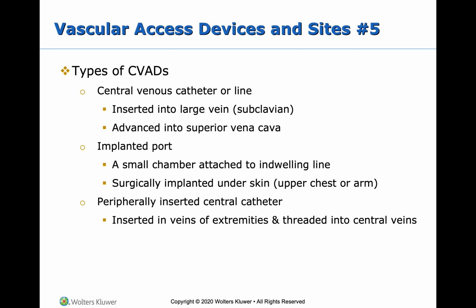The same way that we transfer the blood from the SPS tube into the syringe, and then from the syringe into the blood culture bottles, is how we're going to transfer from the syringe the nurse draws into our tubing. While we're transferring it into our tubing, we're going to make sure that the nurse is flushing the line again.